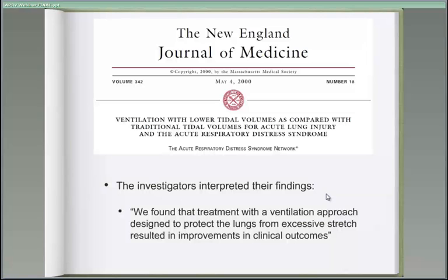If you look at it from a mechanistic perspective, it's not exactly that crystal clear. In fact, there would be several questions raised. For example, none of the low tidal volume studies, ARDSNet and otherwise, have ever shown a reduction in macroscopic barotrauma. You would think if the lung was less stretched, then there would be less barotrauma. But actually, barotrauma would probably not be a good indicator because we have the ability to look down a little bit deeper. In fact, most of this is defended by the notion that there is biotrauma, or microscopic lung inflammation, and that's really what improved the benefit.